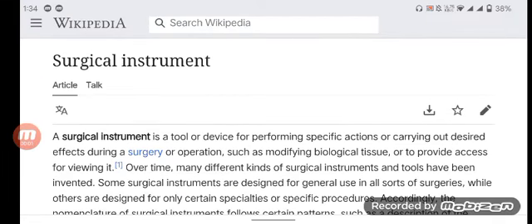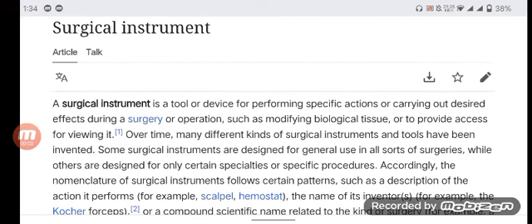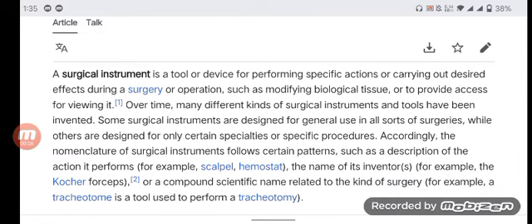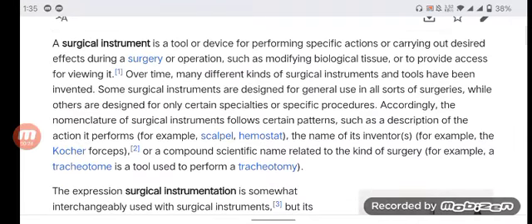A surgical instrument is a tool or device for performing specific actions or carrying out desired effects during a surgery or operation, such as modifying biological tissue or providing access for viewing it. Over time, many different kinds of surgical instruments and tools have been invented. Some surgical instruments are designed for general use in all sorts of surgeries, while others are designed for only certain specialties or specific procedures.